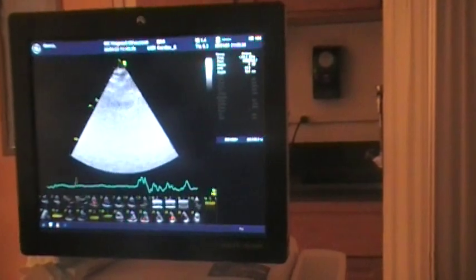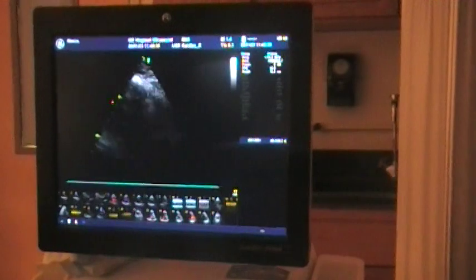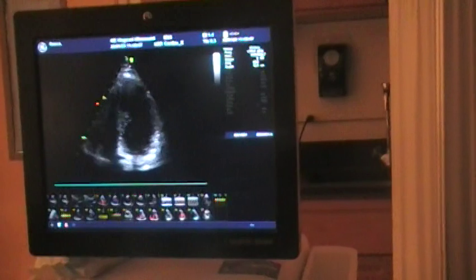All right, I'm going to be under your breast, so let me cover you this way. Your reference point is towards the bed for apicals. Apicals are usually people's least favorite view to do. Give me just a minute to get situated. Okay.